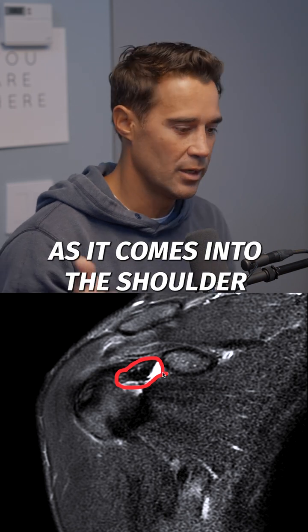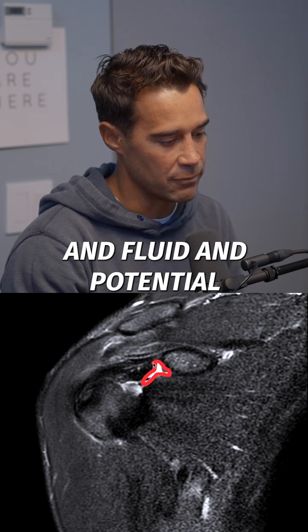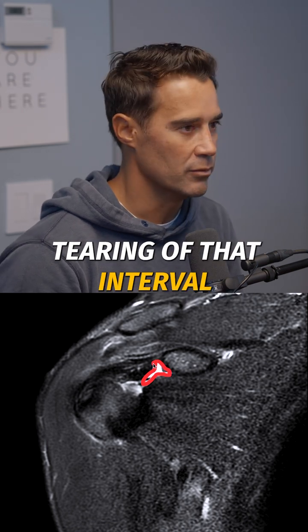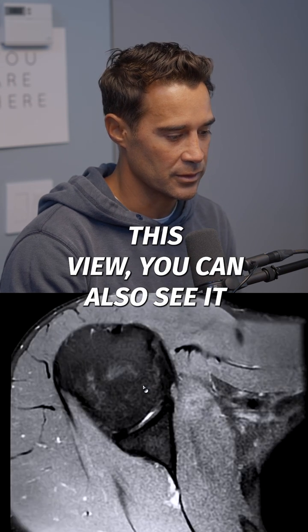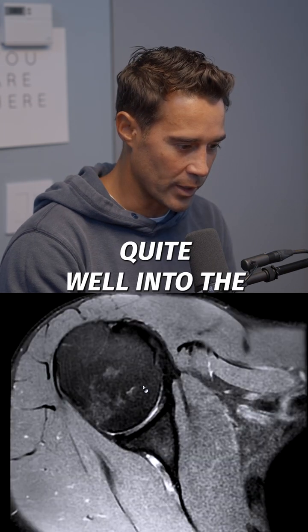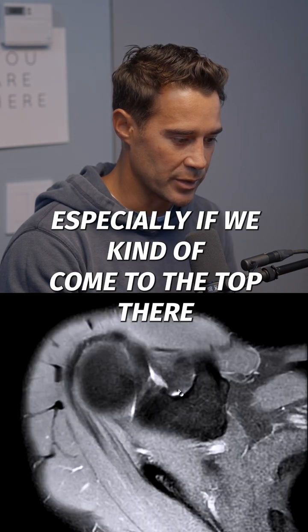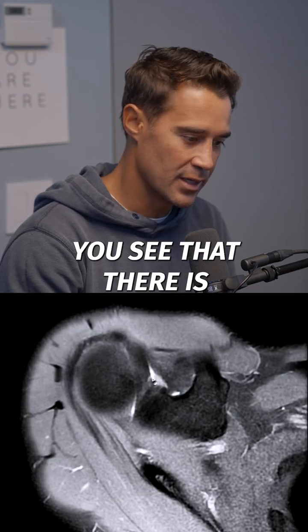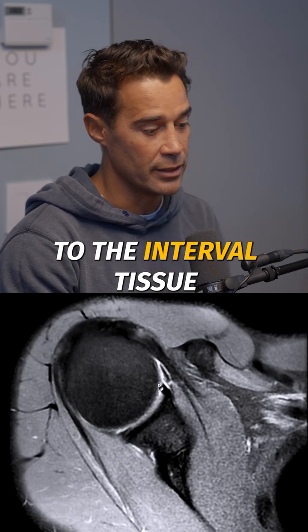You can see there's white fluid in the area, and so it looks like there's swelling and fluid and potential tearing of that interval portion of the shoulder. If we go to this view, you can also see it quite well into the front of the shoulder — all that white you're seeing behind that coracoid, especially as we come to the top, you can see there is a lesion, if you will, or an injury to the interval tissue.